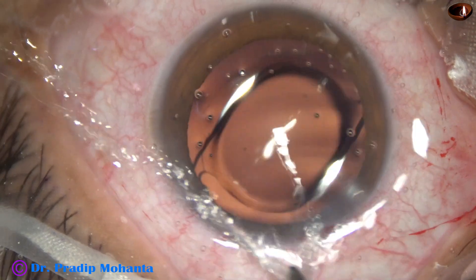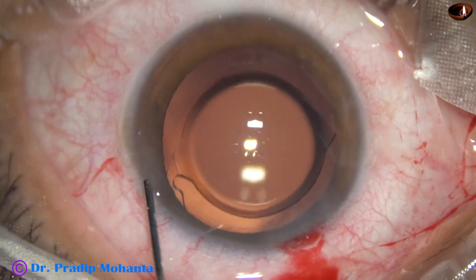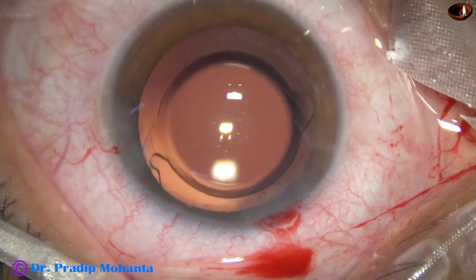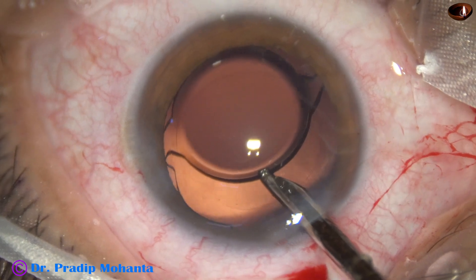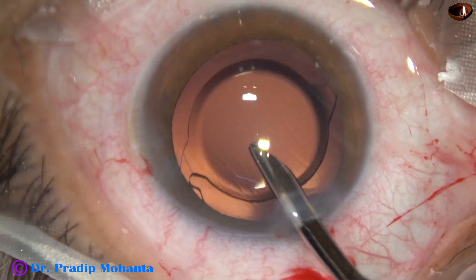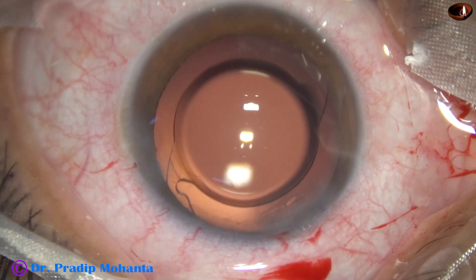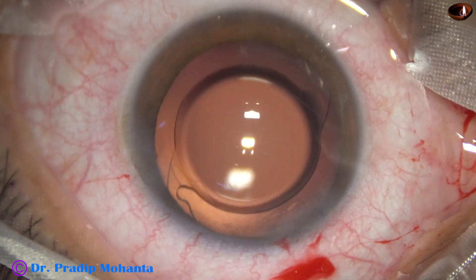Those who have got this lens are happy. The side port is closed by hydrating the corneal stroma. This is the final lavage of the anterior chamber. The capsular bag is also irrigated. The anterior chamber is nicely formed. Integrity of all the wounds is checked and the case is concluded.